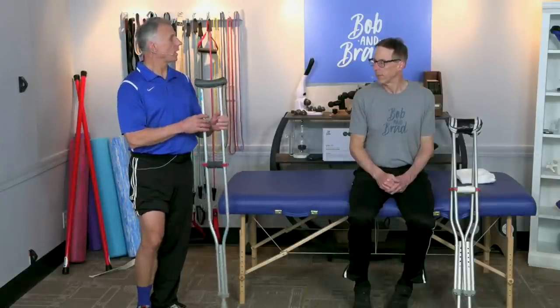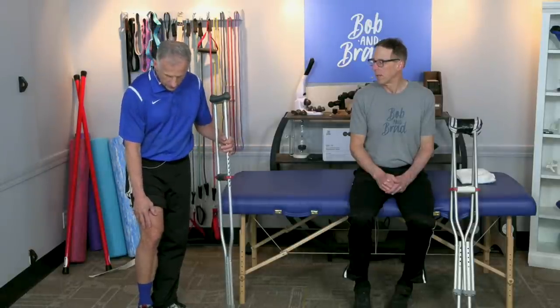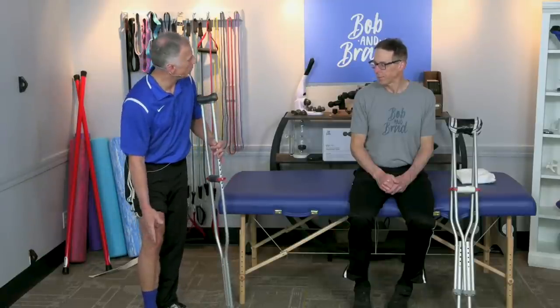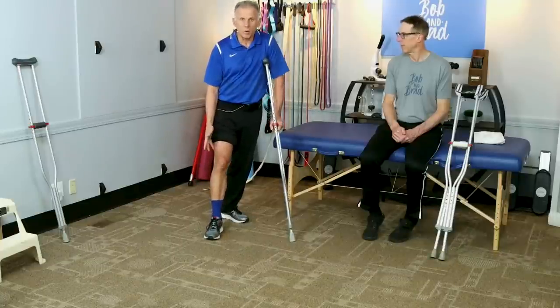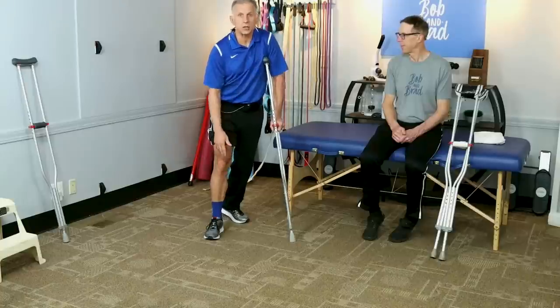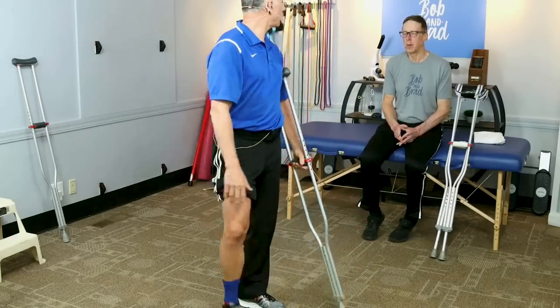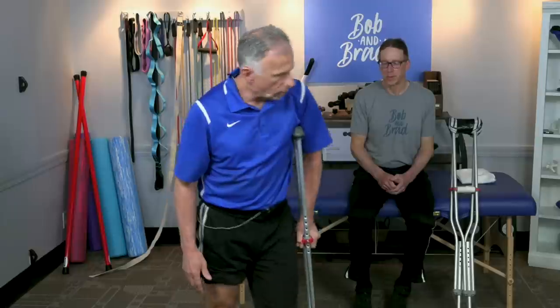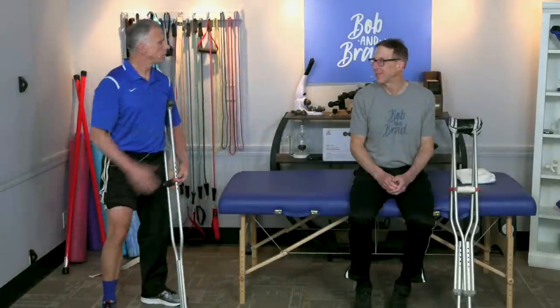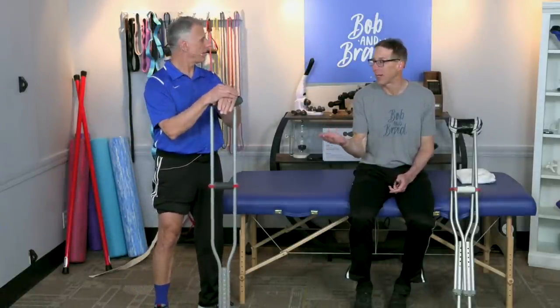Some people will only need one crutch. If you are non-weight bearing on the injured leg, we do not recommend going with one crutch — it's high risk. But if the doctor says you can put most of your weight on it but it's not stable, take the crutch in the opposite hand. The crutch and the injured leg go forward together, and weight is distributed between the crutch and your injured leg. This worked out really well when Bob's wife had an osteoarthritis knee flare-up — she resisted at first, but used it for about three to four weeks, and now she's running.